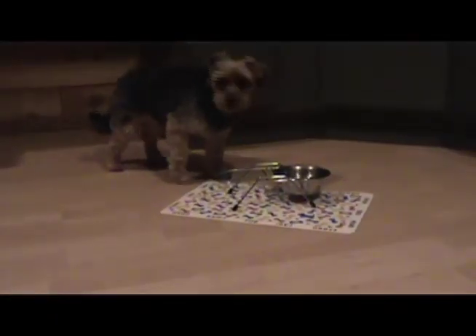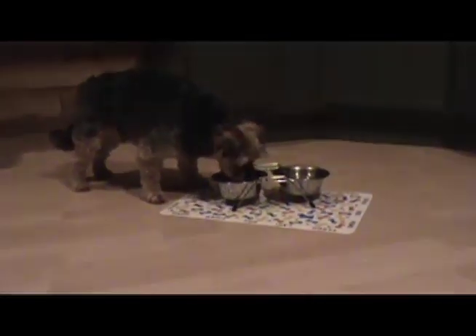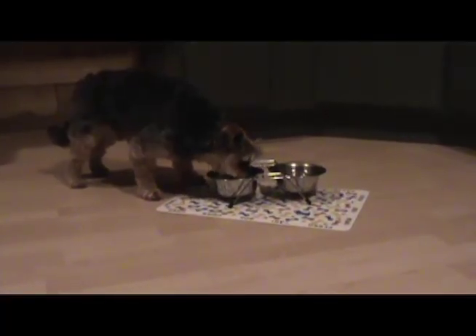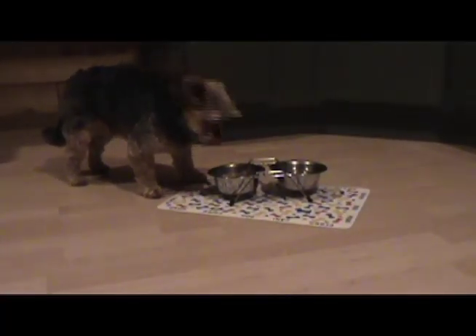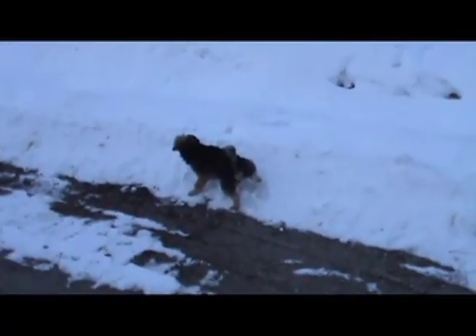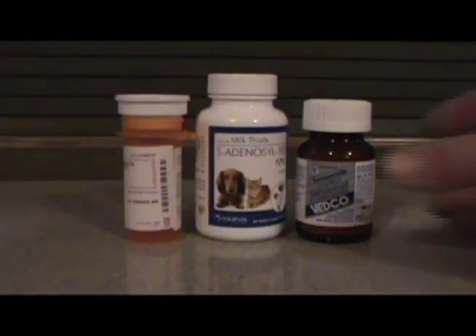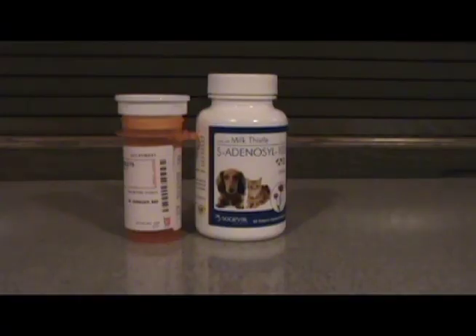Unlike abdominal ultrasound, it is desirable for the patient to have food and water up to the time of the cardiac ultrasound. You do not want the patient to be dehydrated for the study. You may want your receptionist and technicians to stress this with pet owners. The patient can also have a walk to urinate and defecate just before the ultrasound, so they are empty and comfortable. Do not withhold medications on the day of the ultrasound.